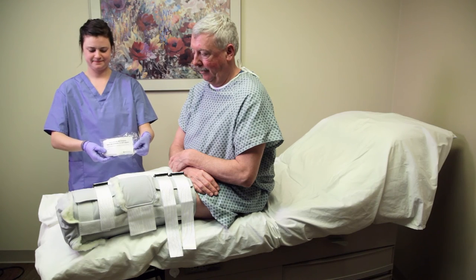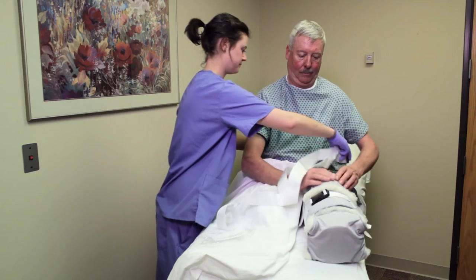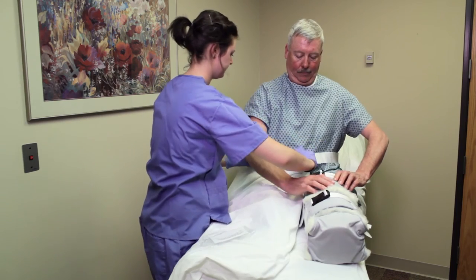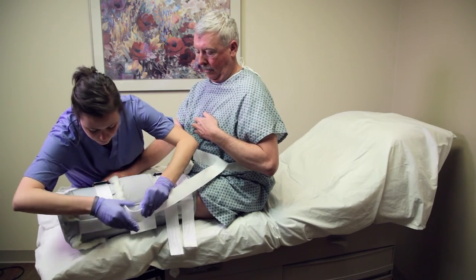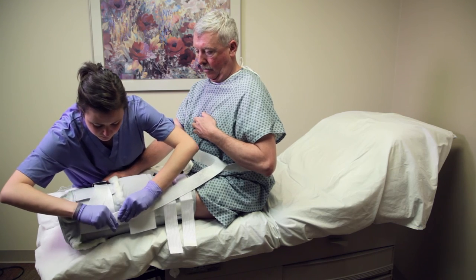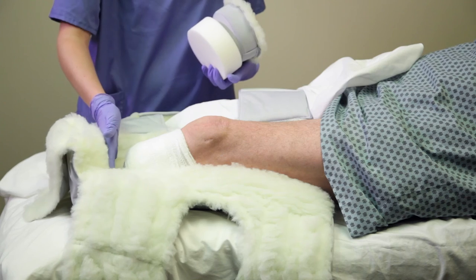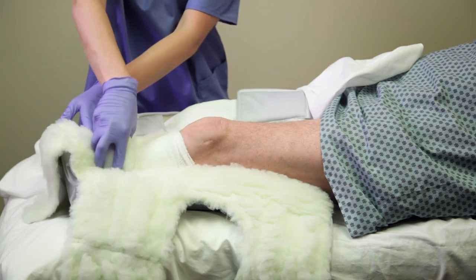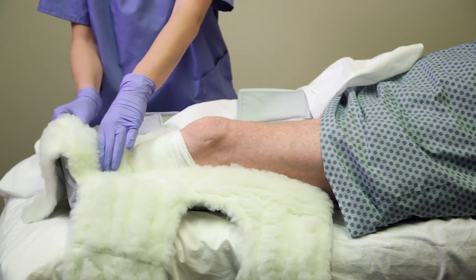If the patient needs to be in a standing or upright position, attach the waist belt, which is included. First, fit the belt around the patient's waist using the buckle and adjusting the strap. Then attach the tail to the outside of the BKA dressing. This will prevent the dressing from slipping down the patient's leg. Note that the spacers placed in the distal end of the Rook BKA dressing also provide excellent protection of the residual limb in the event of a fall or impact on that limb.